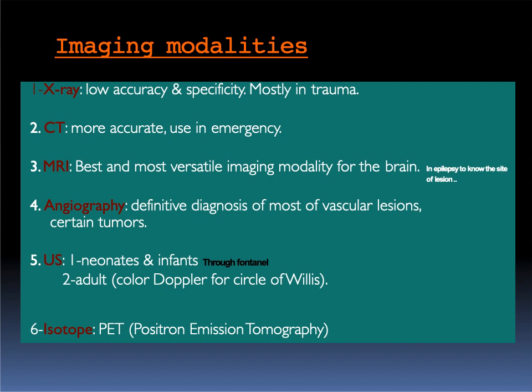So it's very easy to miss a fracture, for example, of the skull or the base of the skull by the X-ray, but it may give you a hint of linear fractures that are very evident. Although there are some pitfalls and difficulties to distinguish between the fractures and the suture lines.